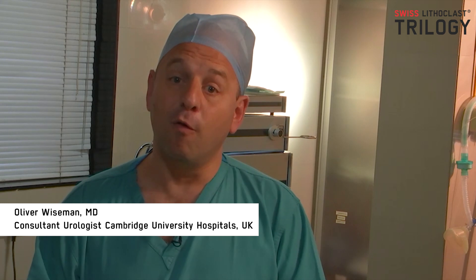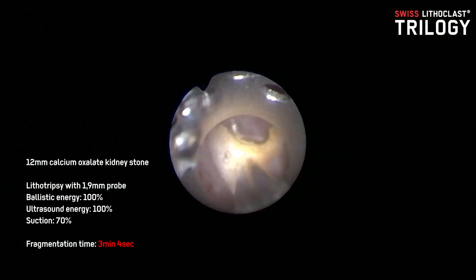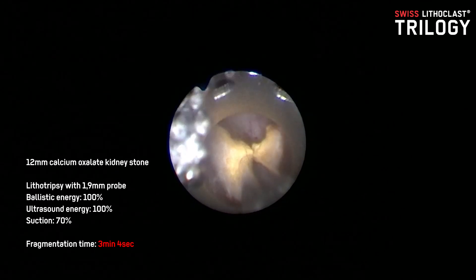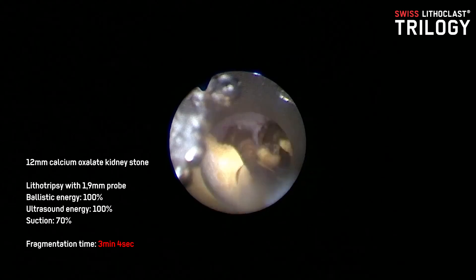Another exciting part is its potential use for miniaturized or ultra mini PCNL, where instead of breaking up stones using a laser and relying upon the vacuum effect alone, the suction device will allow us to more quickly remove those stones that we've broken up.